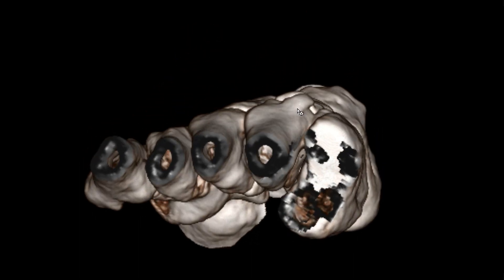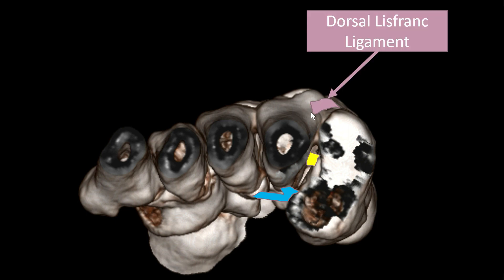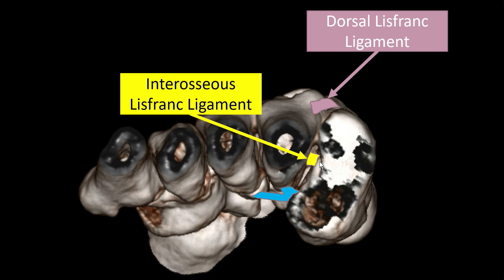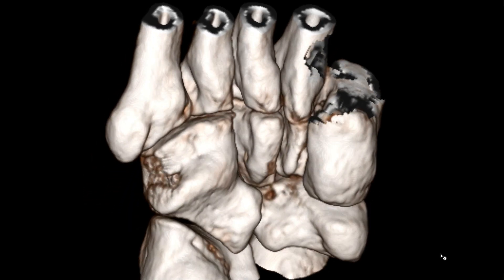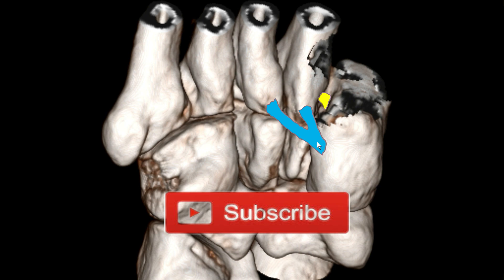In a short axis view you can see the dorsal Lisfranc ligament. In the middle we have the interosseous component, which is the Lisfranc proper. Then on the plantar aspect we have the plantar Lisfranc ligament with its two separate bundles, typically originating from the same area, each one going to the base of the second and third metatarsal bone. This y-shaped ligament is visible in plantar view, with a glimpse of the interosseous component as well.